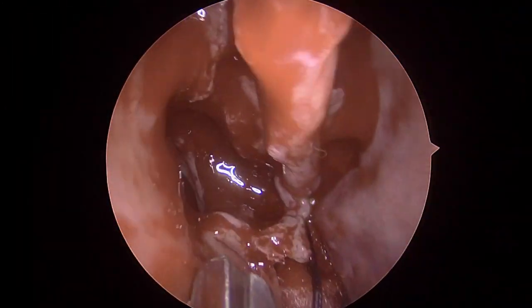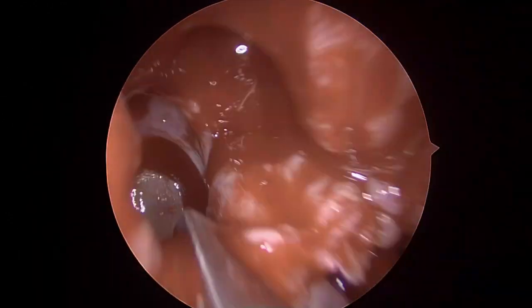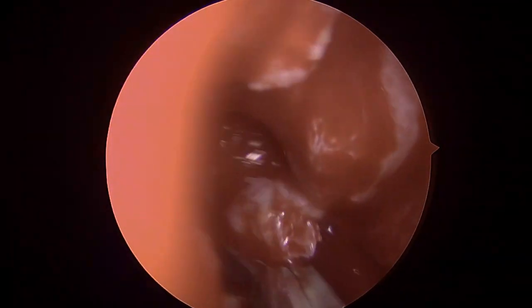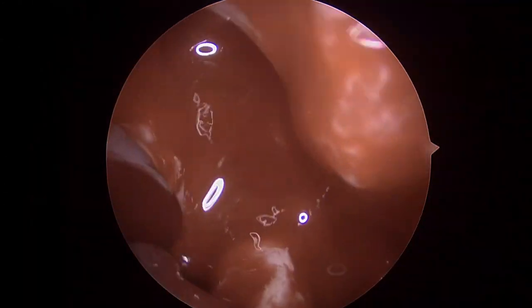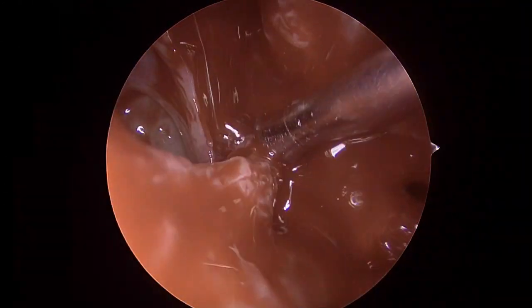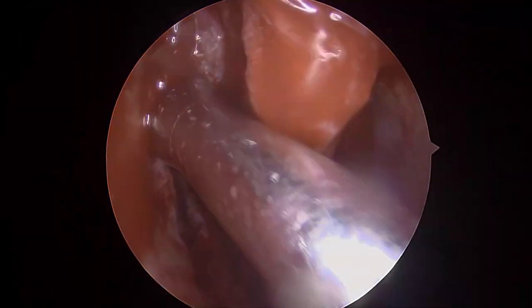And once we do that, we get a glimpse of the maxillary ostium which we have opened widely. And now, as you can see, I'm using a true biting forceps to remove the horizontal part of the uncinate. So you always open the maxillary ostium as wide as possible posteriorly.